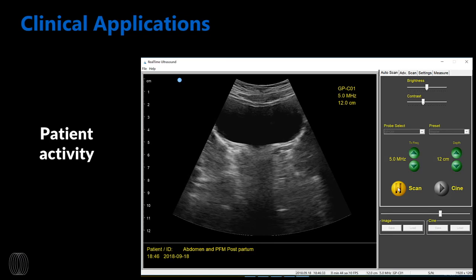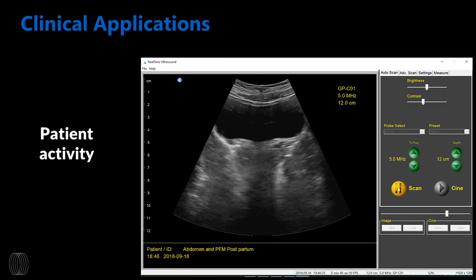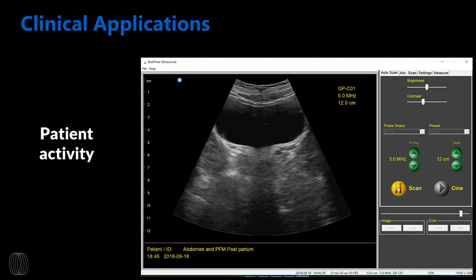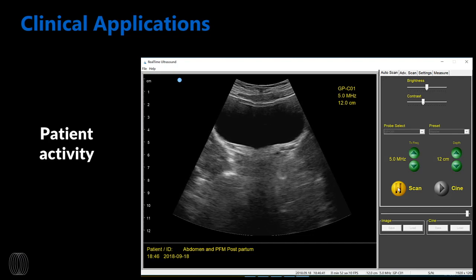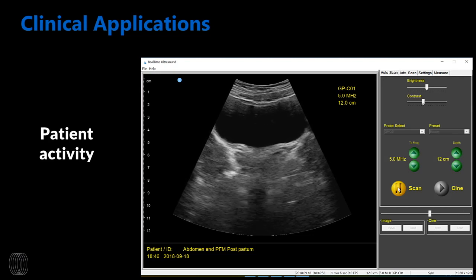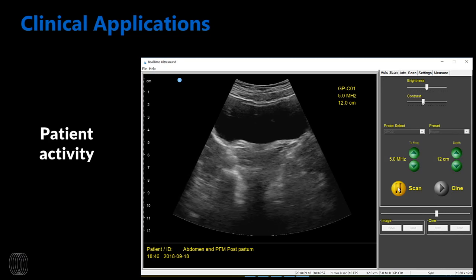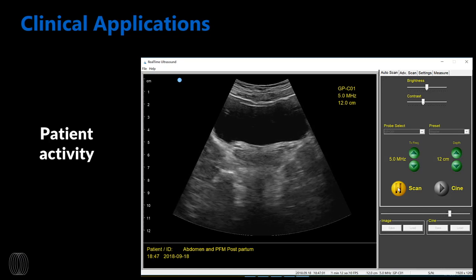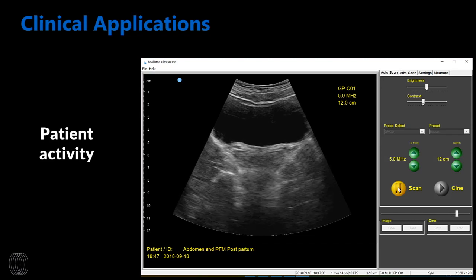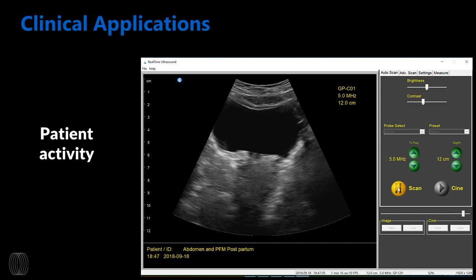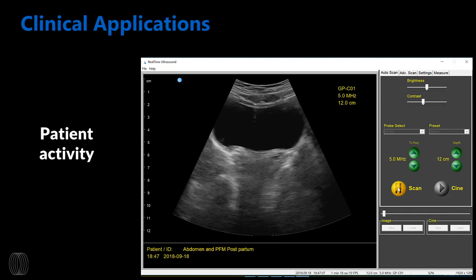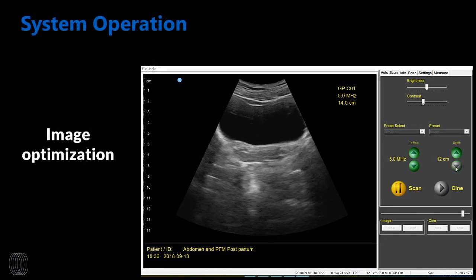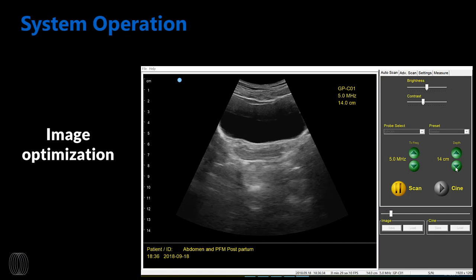Returning to our 30-year-old postpartum mom: first we can see a perfect pelvic floor muscle activation with a beautiful image of funneling. Next, she activates her core and I ask her to perform an active straight leg raise. She struggles with this, and you can see loads of bearing down, which is indicative of poor core stability. The preset is all that's needed to obtain an excellent image quality.